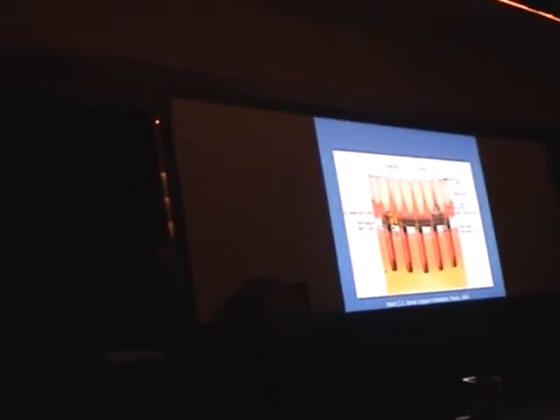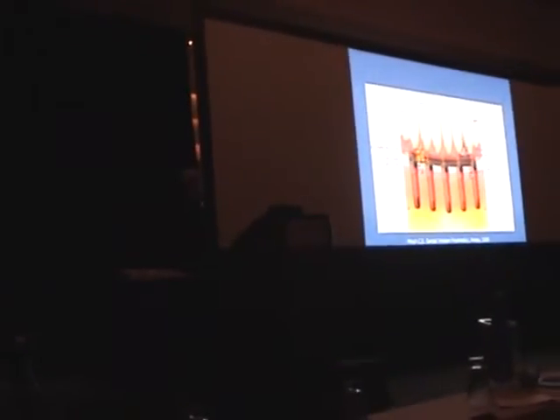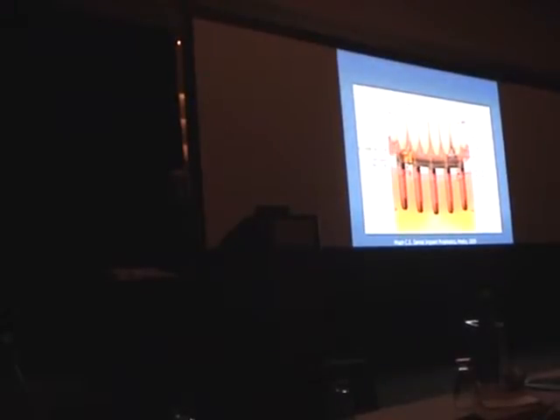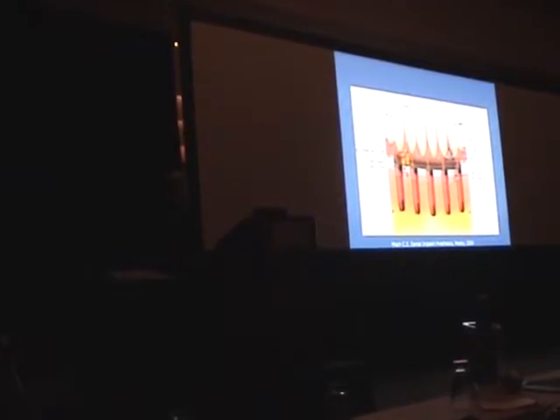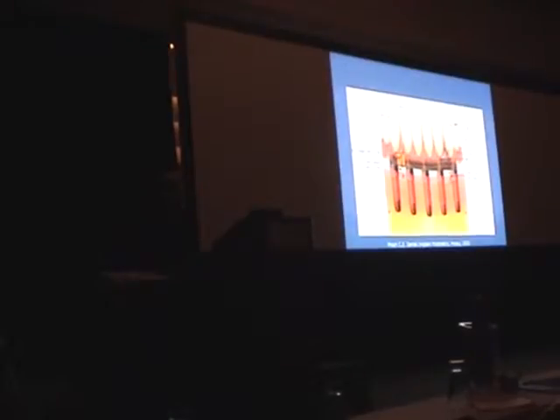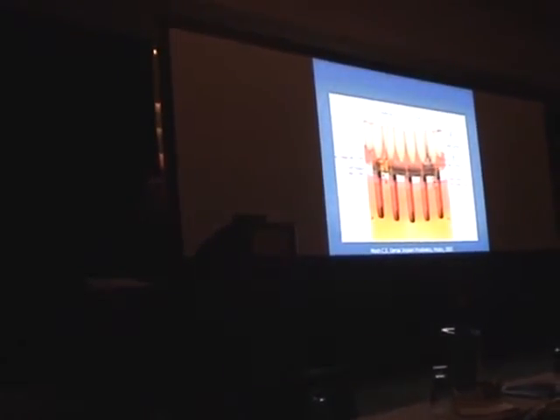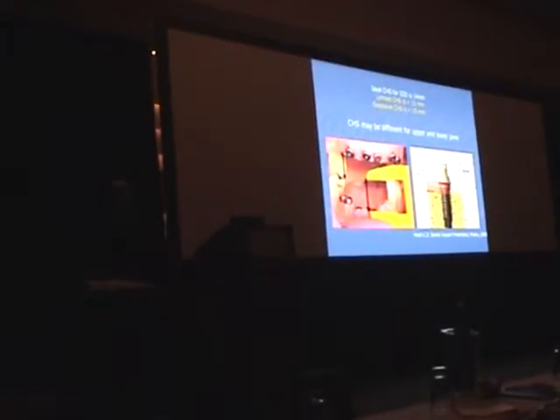At least 12 millimeter from soft tissue to occlusal plane is needed for implant overdentures. As you see here, we need 8 millimeter for the teeth and the acrylic, at least 3 millimeter for the bar, the shortest bar. If you use bar and O-ring, 5 millimeter, and soft tissue for hygiene considerations, at least 1 millimeter. So altogether, 12 millimeters needed, maybe more. An ideal crown height space for implant overdenture is about 14 millimeter.